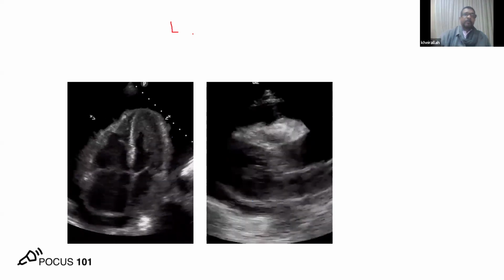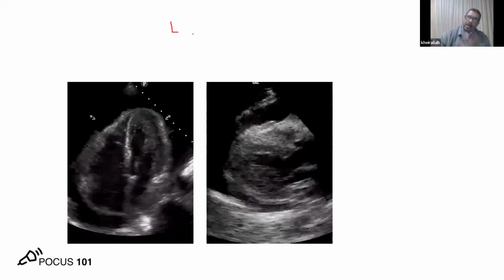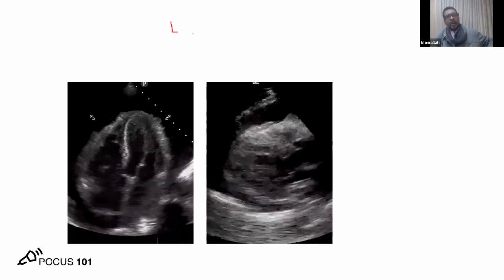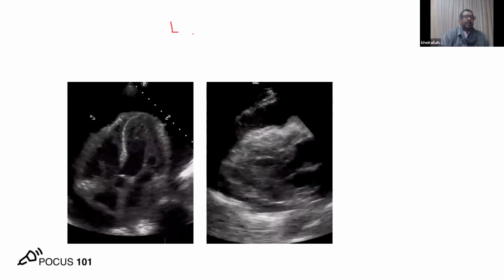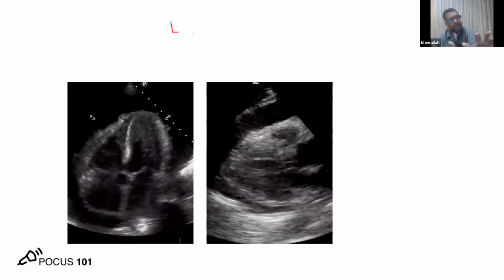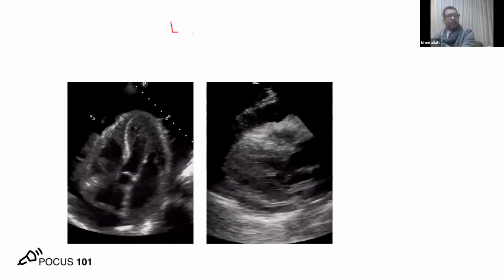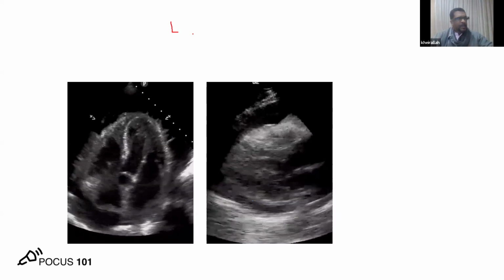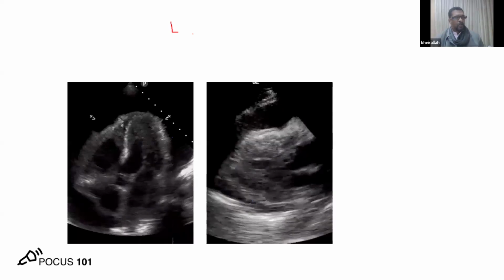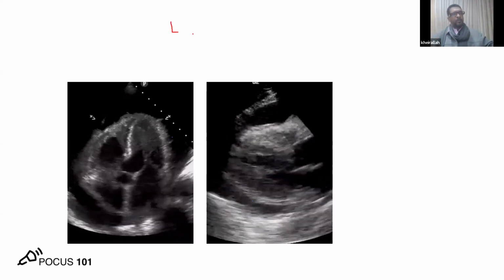Okay, or if you say that there is no evidence of compression, again the decision is made, or you help in decision making by these statements. So it's important you quantify the effusion and you qualify the effect of the effusion on the heart. And this is always the message in echo. In echo, we do two kinds of roles.